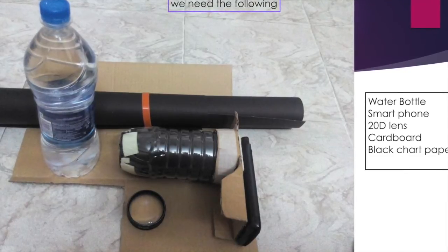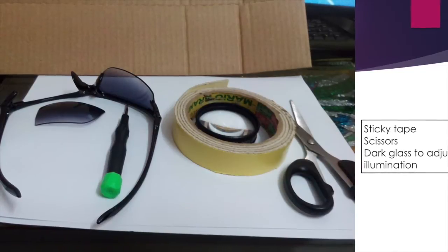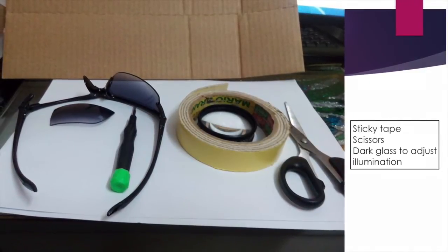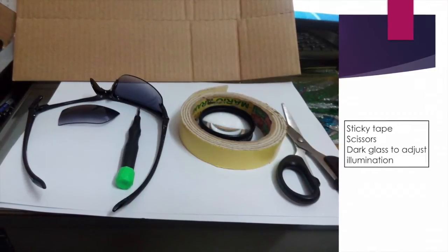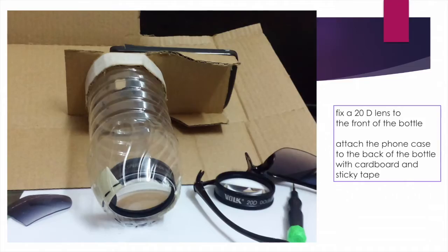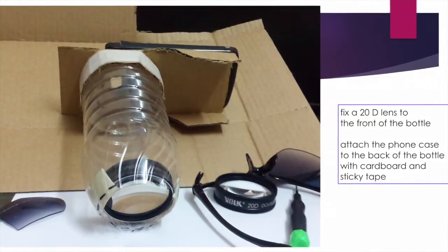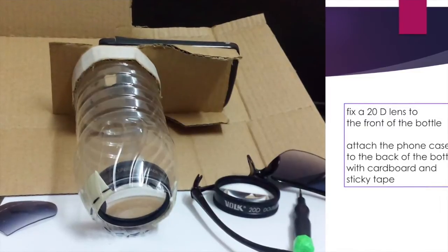You also need some sticky tape, a pair of scissors. Some of us will have a phone where the video light cannot be controlled, in which case we will need sunglasses — we can take a piece from that to reduce the illumination of the video light. So cut the narrow end of the water bottle and fix the plus 20D lens inside with some sticky tape.